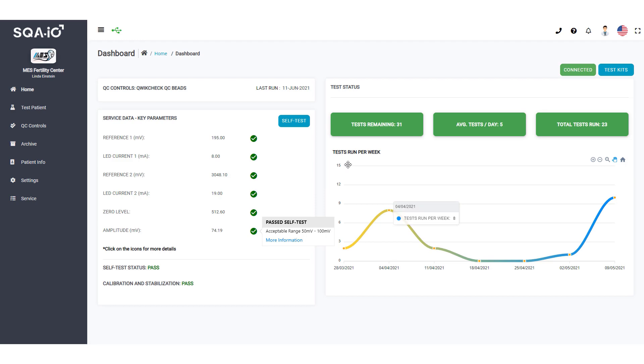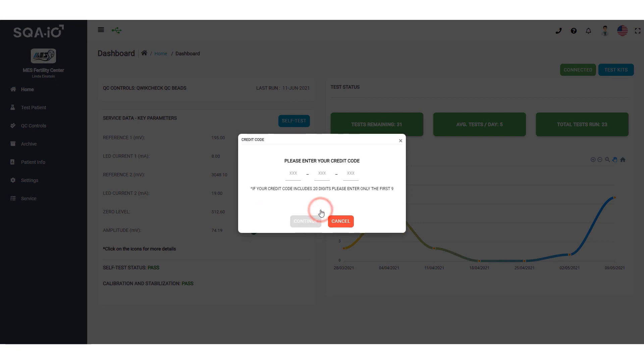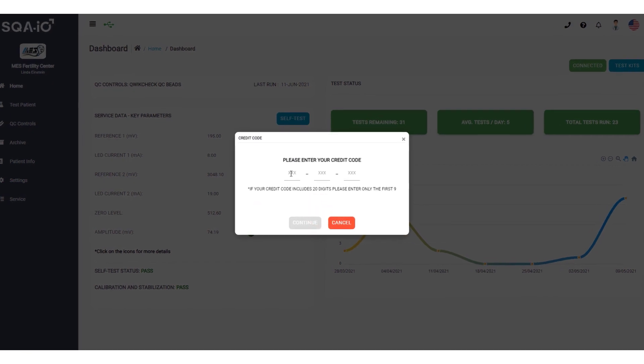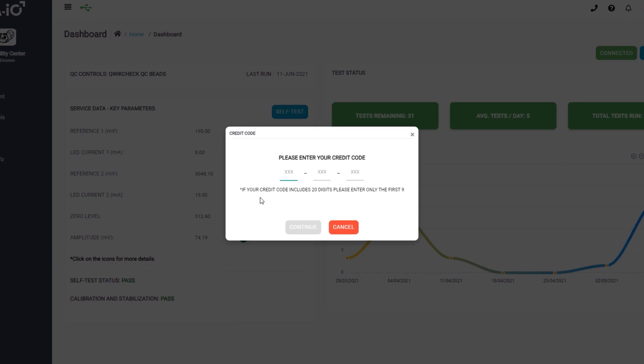Observe the number of test credits remaining so you can plan your next test kit order. Each new test kit has a unique 9-digit test credit code for you to enter. Enter the 9-digit test credit code to add an additional 50 test credits.